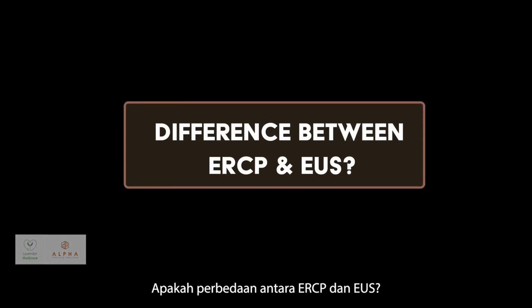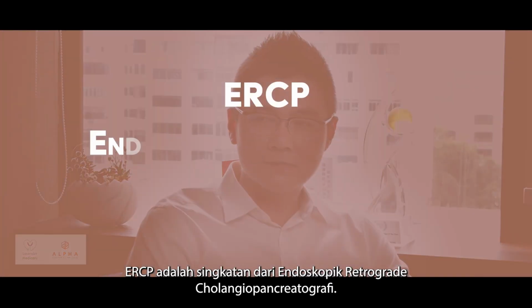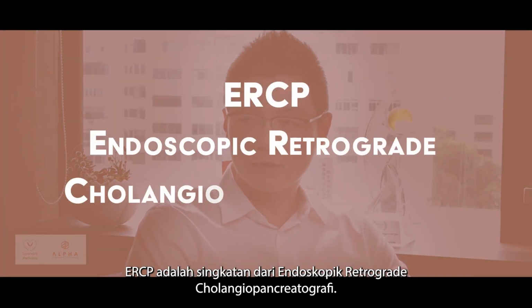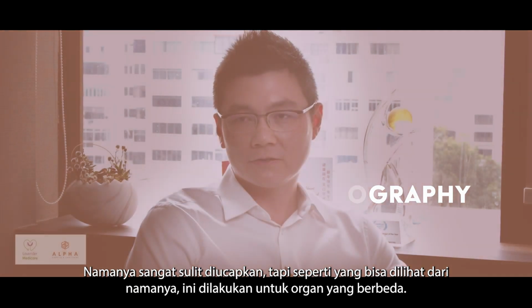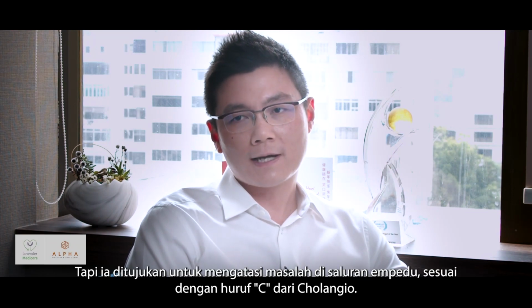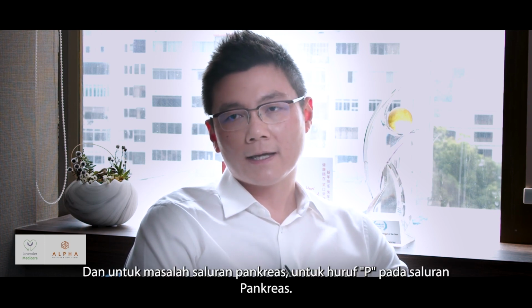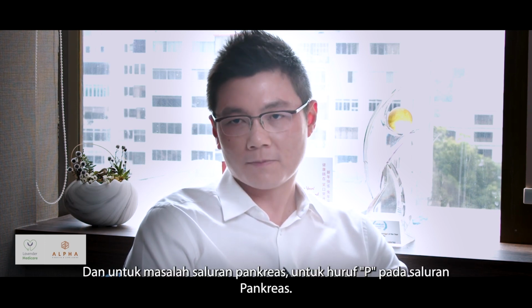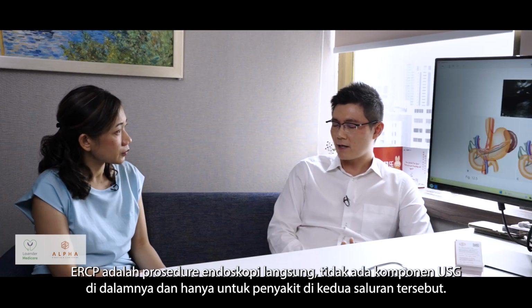So what's the difference between ERCP and EUS? ERCP stands for endoscopic retrograde cholangiopancreatography. It's a mouthful, but as the name suggests, it's a different entity altogether. It's also an advanced endoscopy procedure, but used to target problems in the bile duct, which is the C part, cholangio, and to target the pancreas duct, which is the P part, the pancreatic duct. ERCP is a direct endoscopy procedure. There's no ultrasound component, and it's only for diseases in these two tracts.